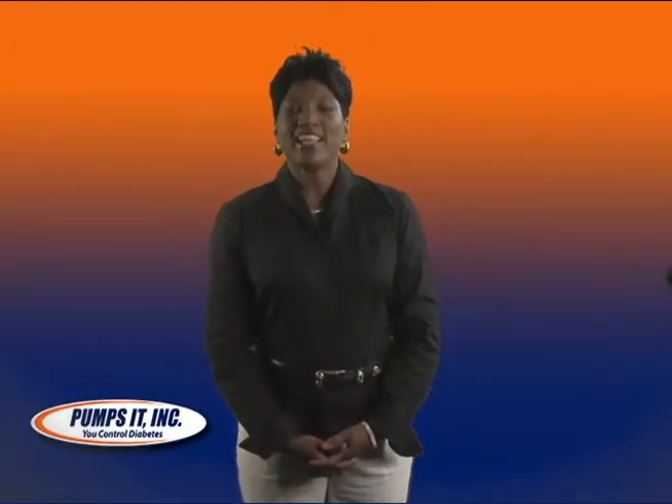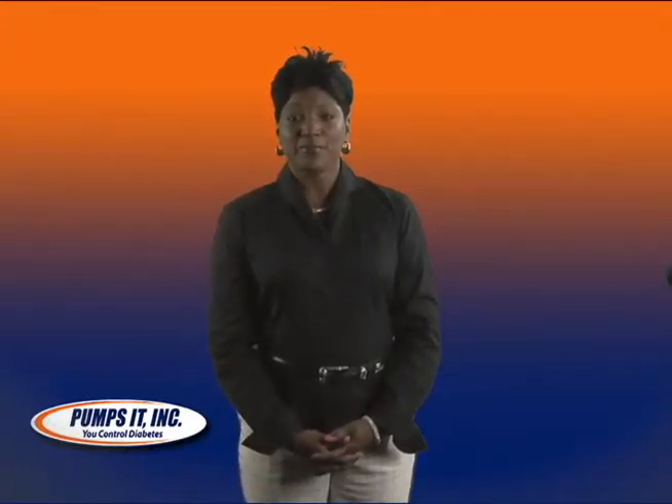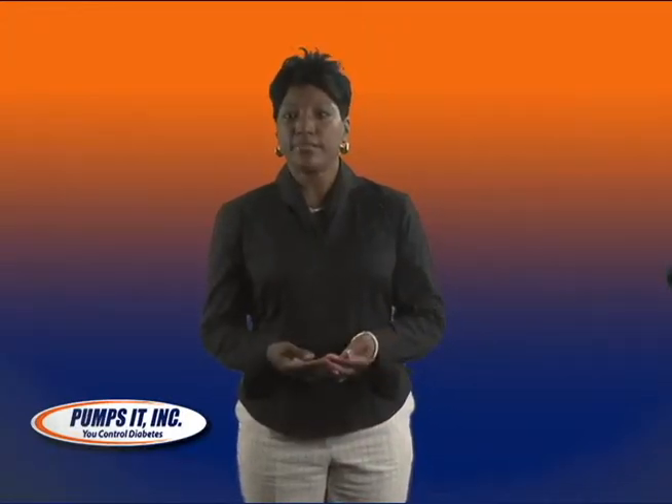Hi, I'm Carol Hill and I'm the Clinical Director for Pumps It Incorporated. I'm going to be sharing with you today some tips on various ways that you can wear your insulin pump.